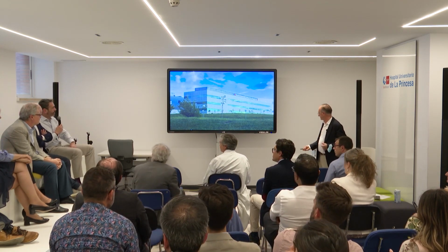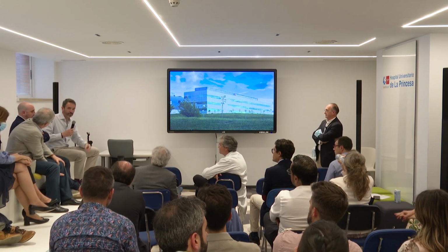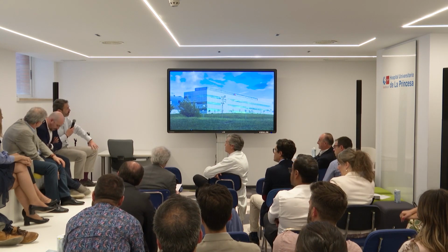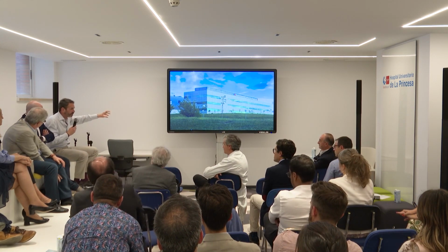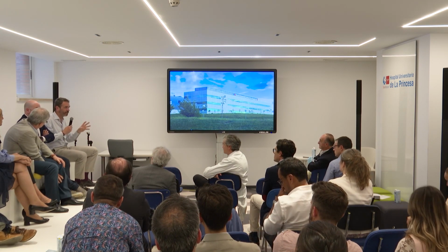Another very nice talk. I give you my position after having also listened to Adnan and Ziad. You know, I was discussing about bombing with the first 2 devices. I think that now, if we have heavily calcified lesions as seen by intravascular imaging, so thick calcifications, 360 or 270, whatever, I think that there is no role for these devices for any cutting or scoring balloon, because we have very, very effective and good devices.